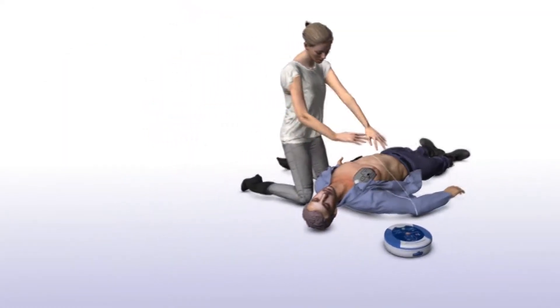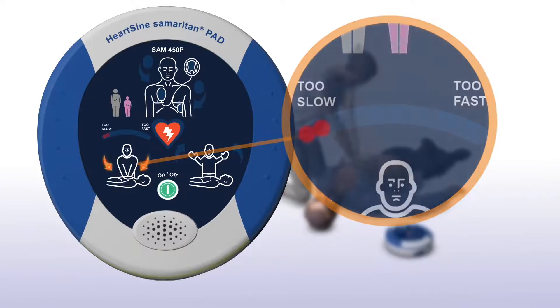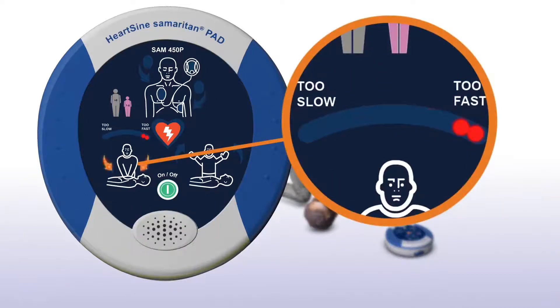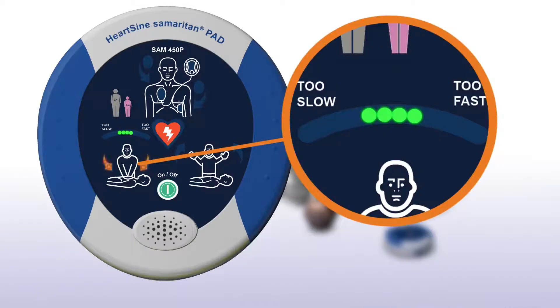If you are performing chest compressions at a rate slower than current guidelines, the SAM 450P will prompt: "Push faster." If you are compressing faster than current guidelines, it will prompt: "Push slower." When your compression rate is within the recommended range, the device will reassure you that you are providing an optimal compression rate.